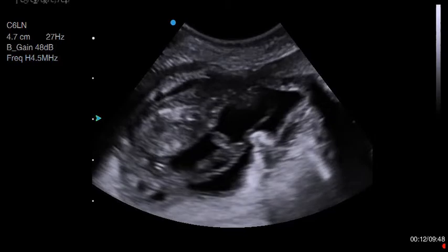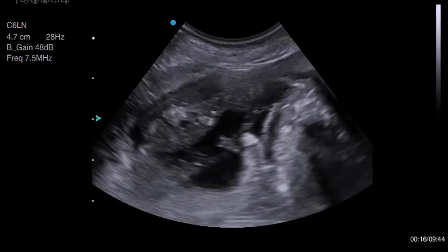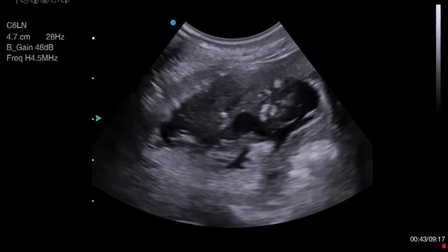But now watch as I turn it off. Can you see that in the near field the image is now a lot murkier? And now again with THI off, and the difference it makes when it's turned back on.